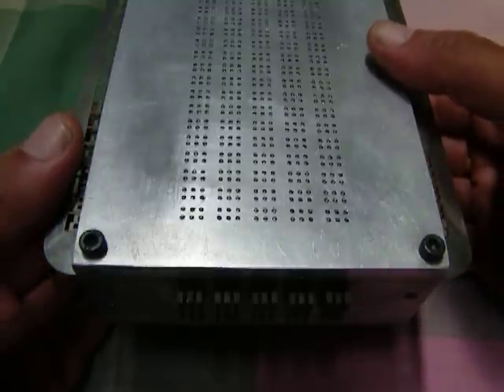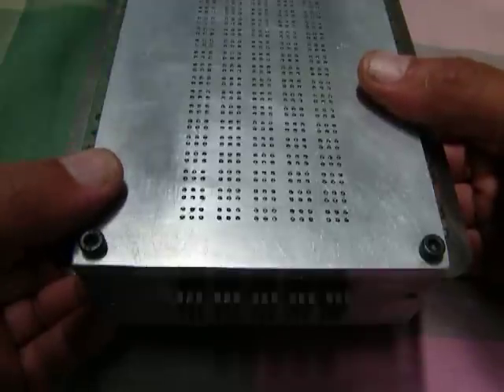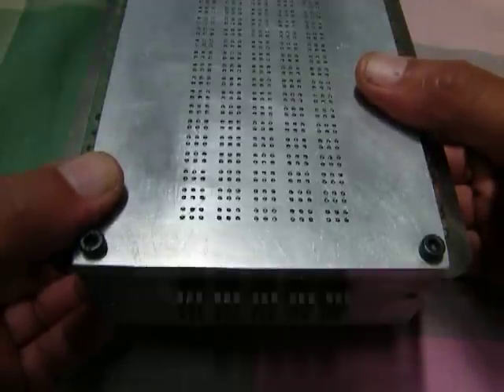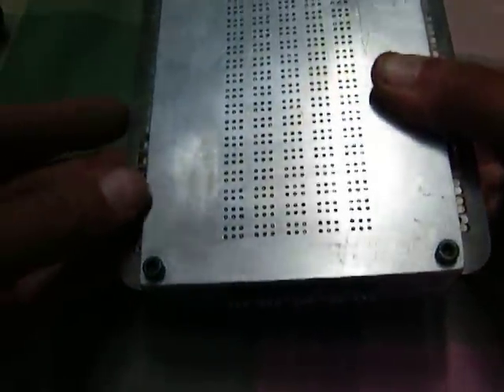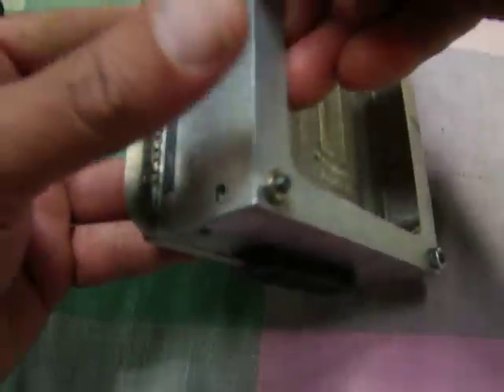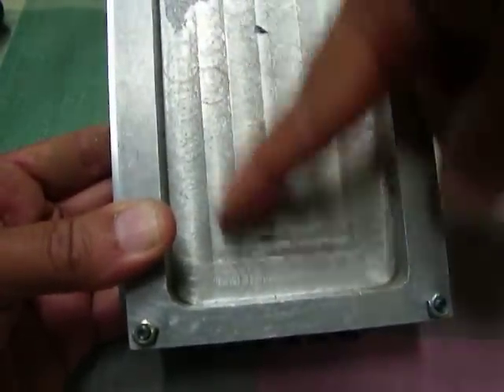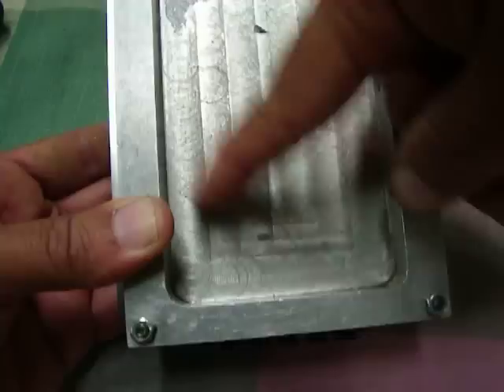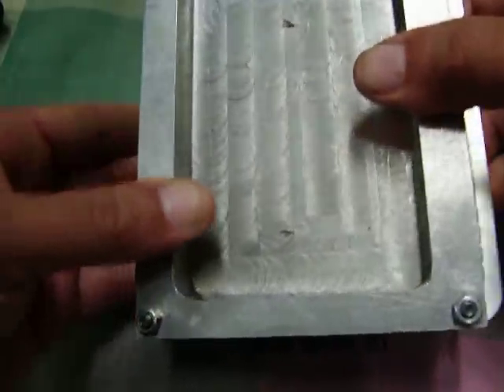In this video, I'm going to try and show you the row and column actuators and how they work to control individual pins of each cell. I'll just flip this device over so that you can see the underside, which is actually nothing at all. It's just a cavity in the block machined here so that some of the controllers and the other stuff that I have in mind will go into that empty space over there.